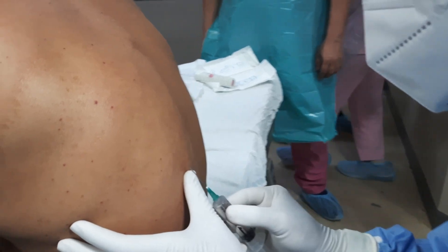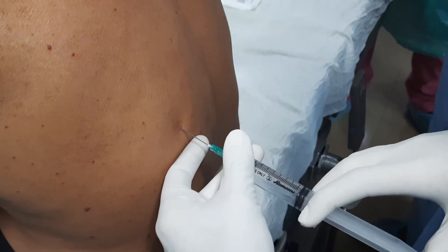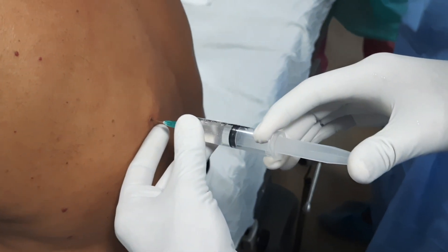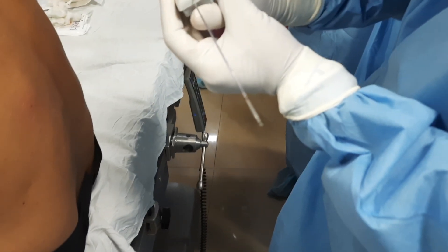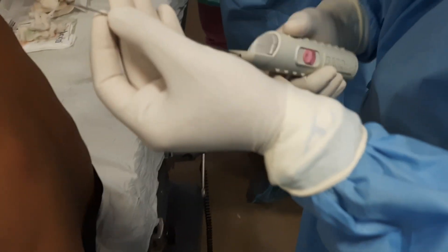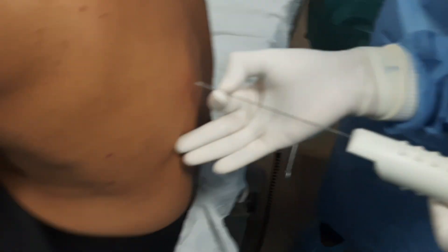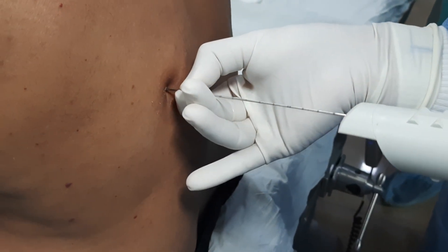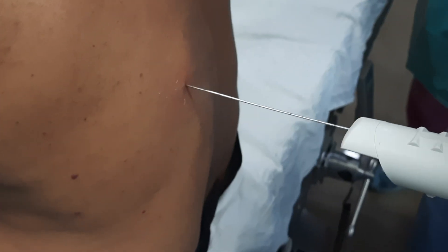Now we will give local anesthesia: 1% xylocaine mixed with adrenaline. We will withdraw and check whether blood is coming — there is no blood. Because we are going to insert an 18-gauge needle which is painful, local anesthesia is very important. Now we will push both levers inside so both needles go inside. We are going to insert 2.5 centimeters — every black mark is 1 centimeter. After insertion we will check position in ultrasound again.